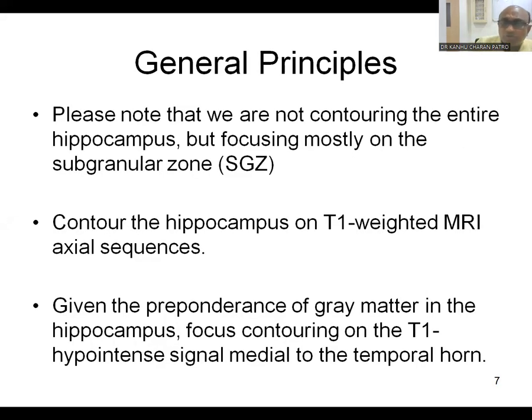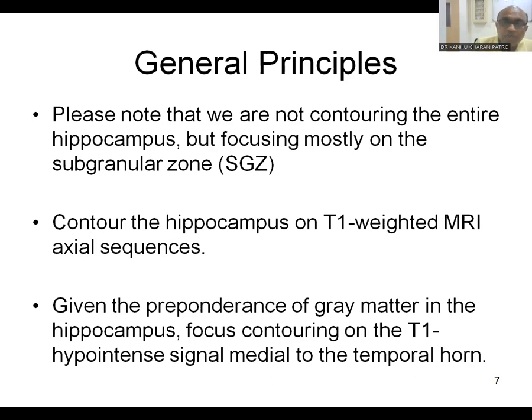The general principle is that the subgranular zone must be contoured. Contour the hippocampus on T1-weighted MRI sequences. Given the importance of gray matter in the hippocampus, focus contouring on the T1 hypointense area medial to the temporal horn. Remember four landmarks: temporal horn, quadrigeminal cistern, hypointense area, and the posteromedial part — if you remember these four, hippocampus contouring is very simple.